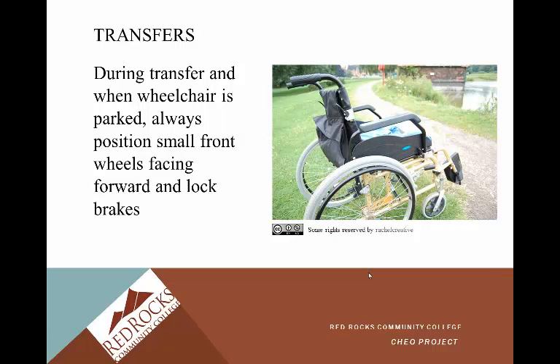During transfer and when the wheelchair is parked, it's always positioned with the small front wheels facing forward and the brakes locked. It's really important that you always have the wheelchair locked before transferring somebody — that's one of your bolded critical steps when you do a transfer to wheelchair. The small front wheels facing forward means it's in good alignment. We'll practice this in class.